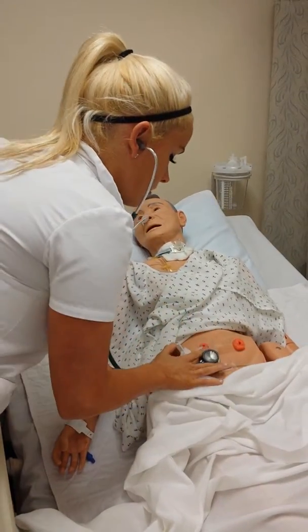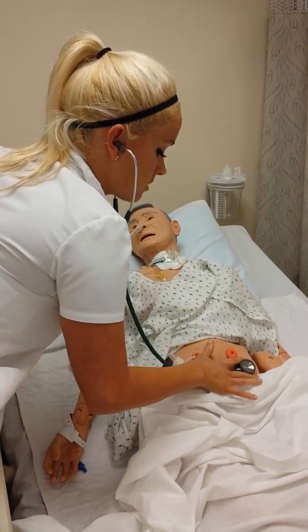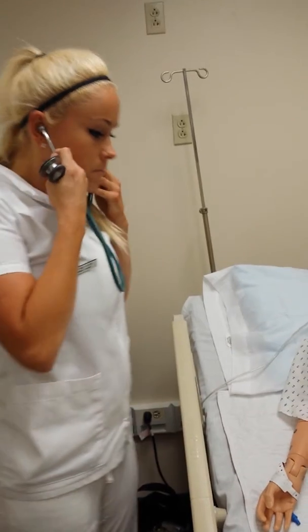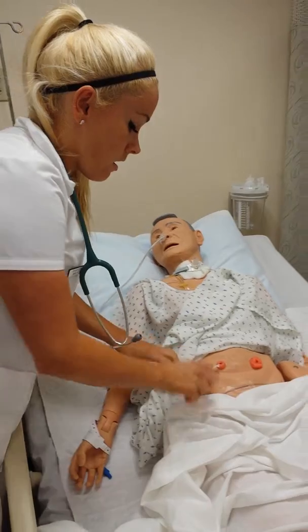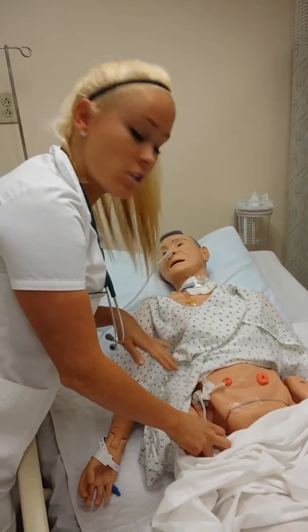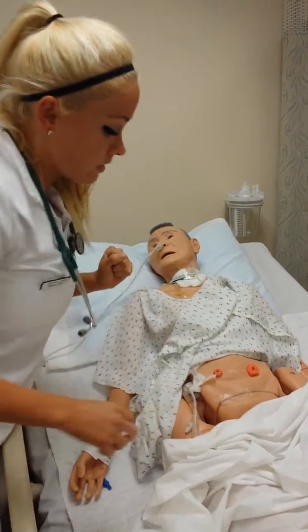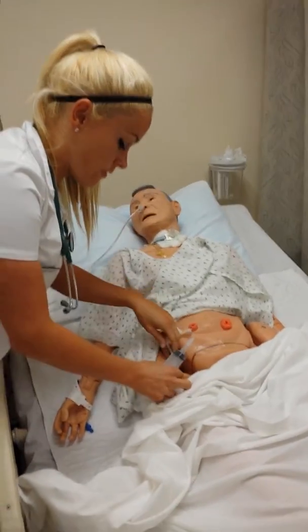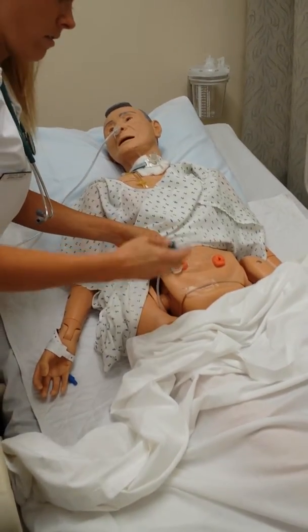We're going to check for bowel sounds. Normally the PEG tube will be in this area — we're going to pretend today. We're going to check around the site, check the stomach for distension, and make sure there's no redness or swelling in the area.